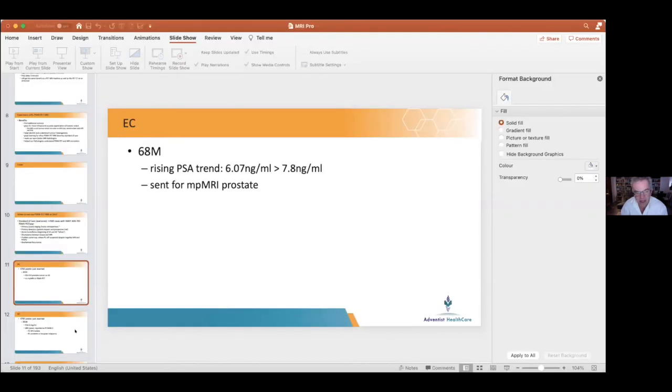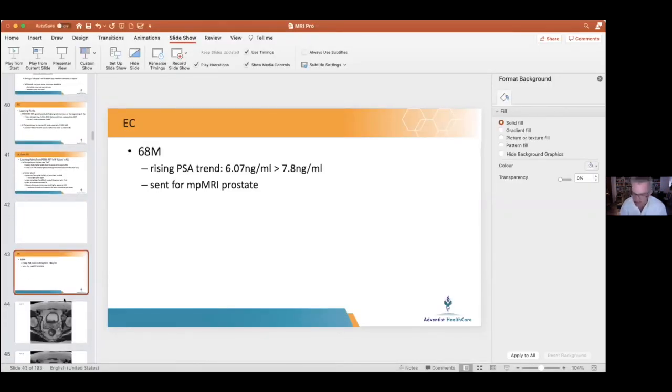Yep. No, I mean, I suppose my question would be, when you do a PSMA PET in these low-risk patients, you get quite a lot of false positives elsewhere, and also you get low avidity, indeterminate signal from the prostate in many patients, and it's just quite difficult. This is obviously an easy case as a barn door signal, but in many, I'm chasing. I did one the other day on a low risk patient, and I'm chasing a thyroid lesion now and a T10 lesion in him, which is requiring a CT scan and ultrasound. So it's just that, and then how you interpret the indeterminate result.